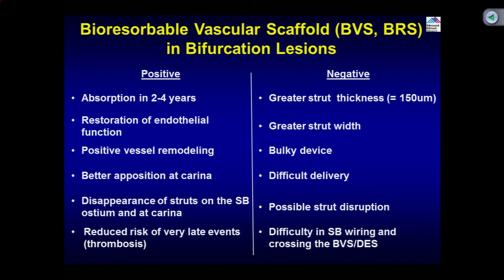If in case you need to do a provisional stenting, and later on you have to put a stent after the stent of the main vessel. Samin, to me this is the real slide and the take-home message for the entire case. Can I provide my own observation and summary on this, and then want you to confirm it? Really, technically you need to get it exactly right, and if you are able to do it, long term you will probably be much better off. Is that correct? That is correct, absolutely.